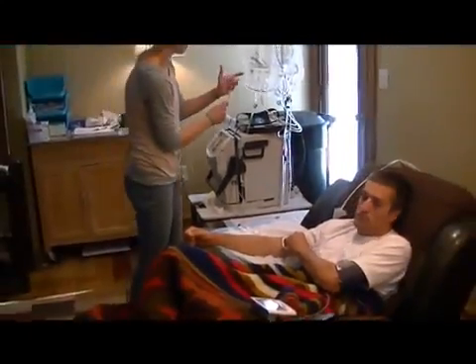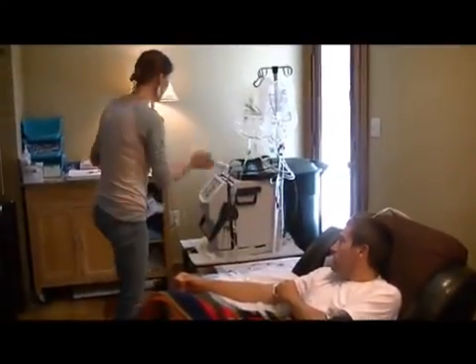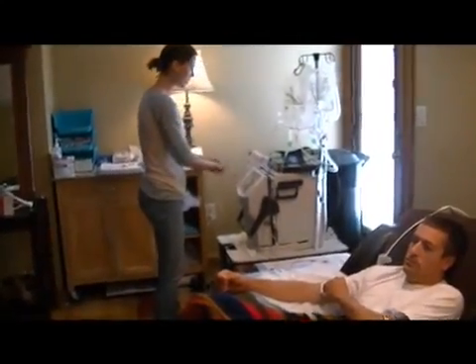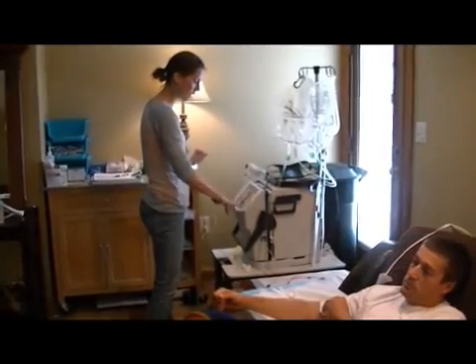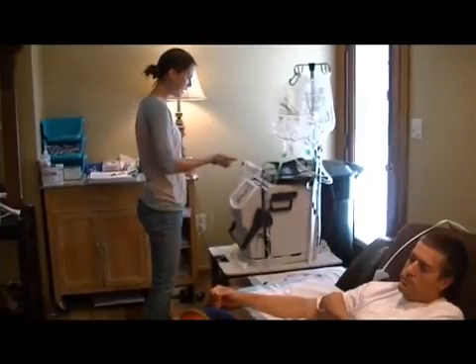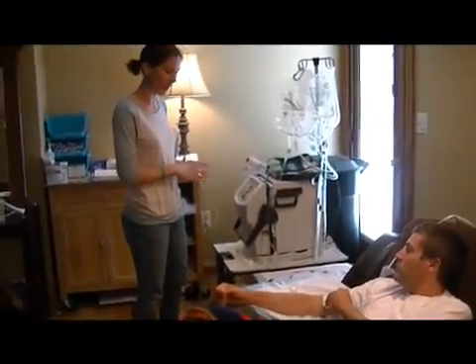And we have a sharps container for all of our needles. And then on the machine, now that it's done, it tells you everything that you've done. So it'll tell us it took 2 hours and 10 minutes, how much dialysate it used, how much fluid you took off, and how many times the blood was circulated. And then you'll turn the machine off, tear all this down, and it goes in the trash. And we end up having a lot of trash afterwards.